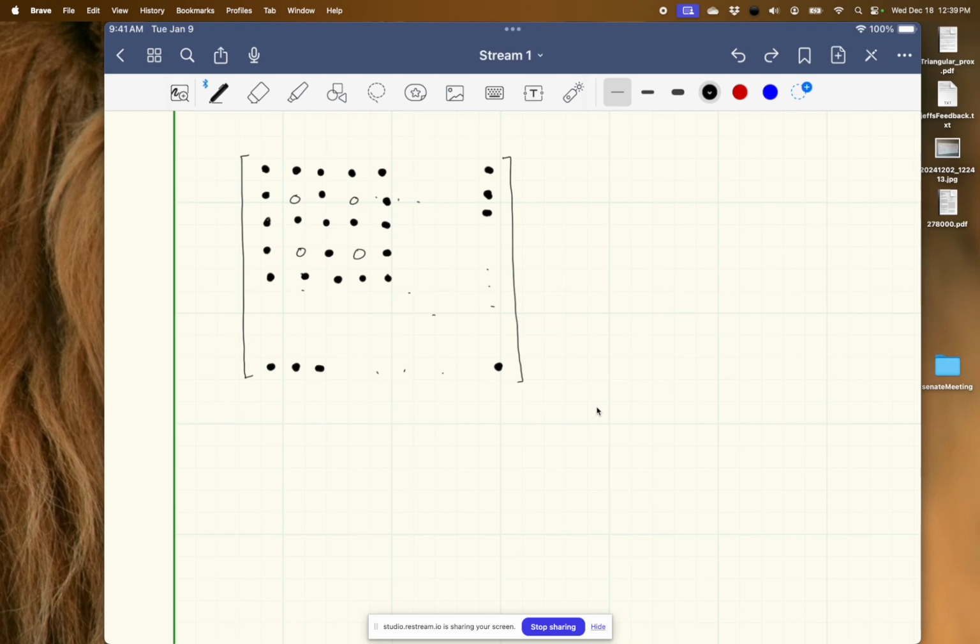And the answer to this question comes from the papers that introduced GRAPPA and SPIRiT. One of the authors of GRAPPA was Sodickson, and one of the authors of SPIRiT was Lustig. And what GRAPPA realized is that, I'm going to zoom into these 9 points here.